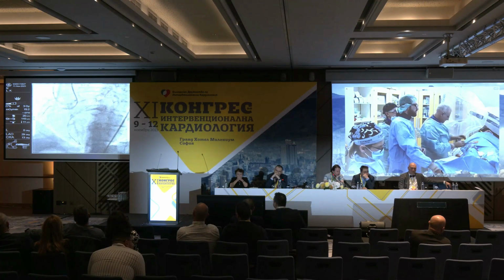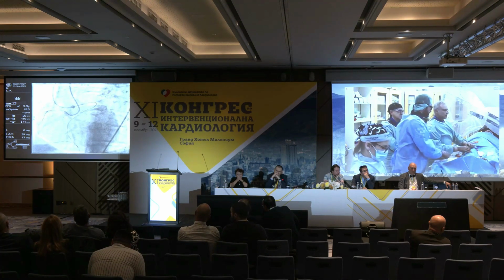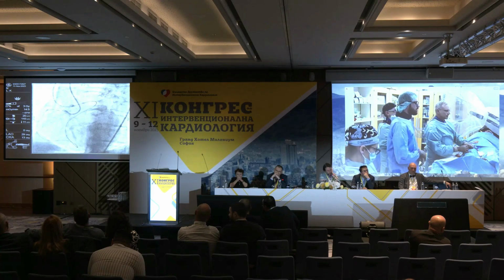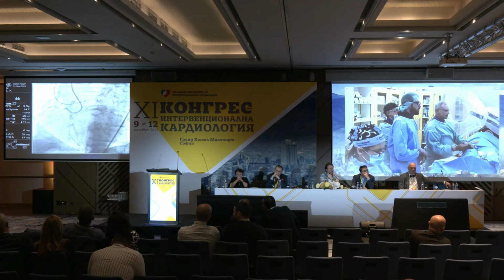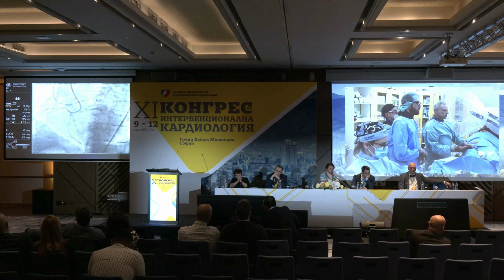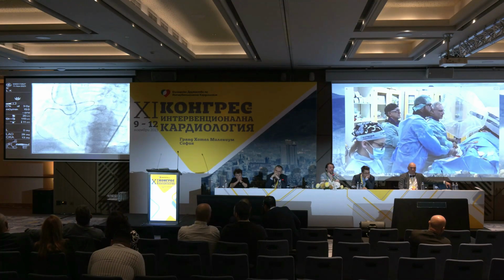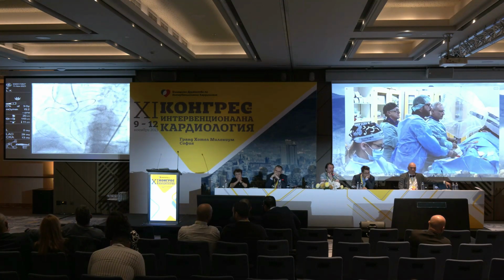So you see that we have this malalignment between the guiding. I'll push the guiding down. When we push the guiding down, it goes out of the ostium. And I will see whether I can target it by any means. What about the guide extension? Yeah, that would also be an option, but contrast a little bit. It's a matter of time now, just to align the two devices. Yeah, no, see, you have now antegrade flow. That's good.